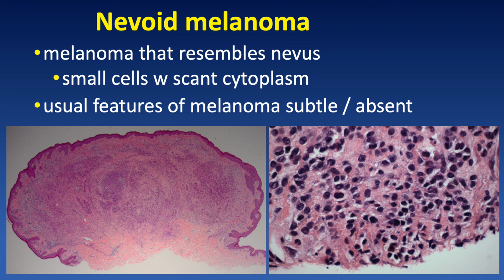By profile these typically are nodules, even polypoid papules or nodules with a profile that at first glance resembles an intradermal congenital pattern acquired nevus, but when one looks closely one can see that there's usually something funny about the growth pattern. The nests are not arranged in the typical fashion of an intradermal nevus. There may be a lack of maturation. There may be smart bombs in the form of an unusually prominent lymphocytic host response.